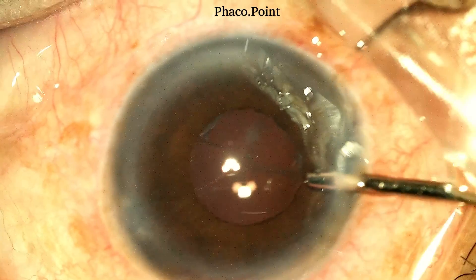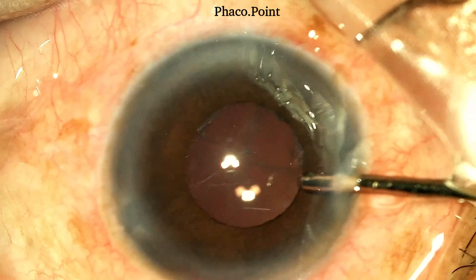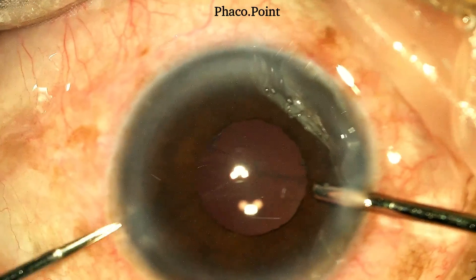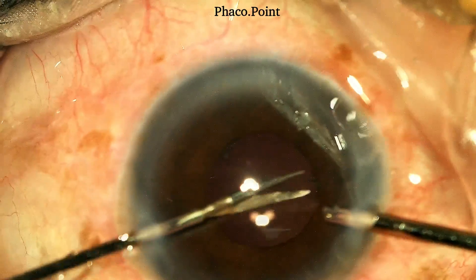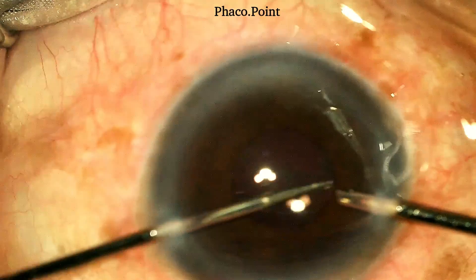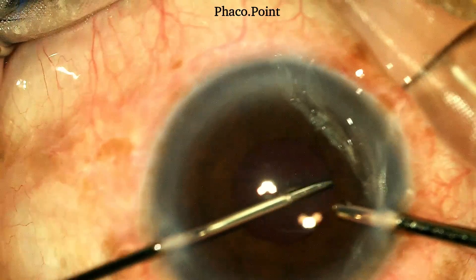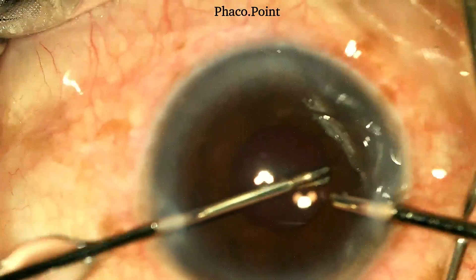Here is how I address this. While maintaining the irrigation still in the eye held in the non-dominant hand, I introduce an intraocular scissors into the anterior chamber, note how I go deep to the pupillary plane, and cut this vitreous strand.